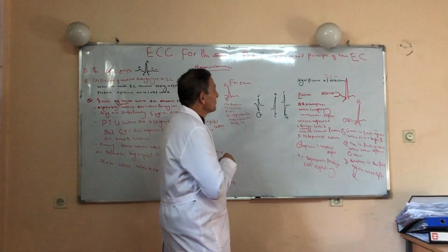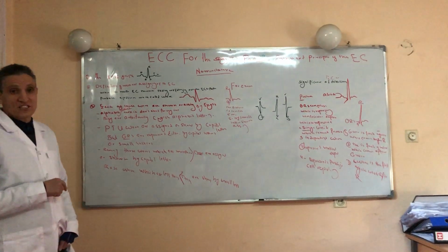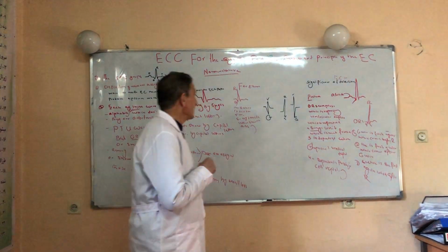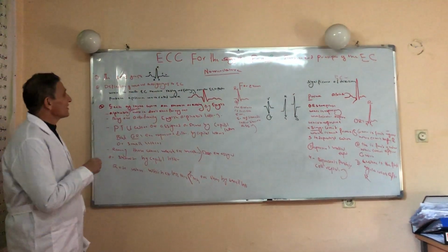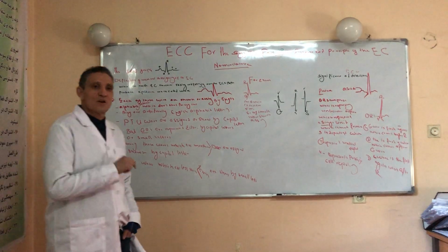13, Basic and Principle of the ECG. In today's lecture, we'll be discussing the nomenclature of the ECG. First, under nomenclature of ECG, we'll be discussing the following topics.